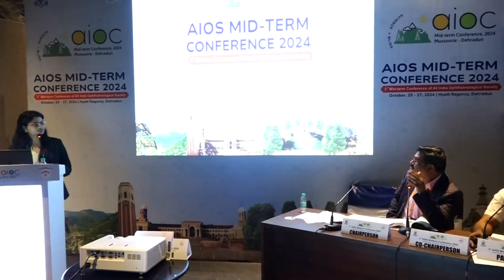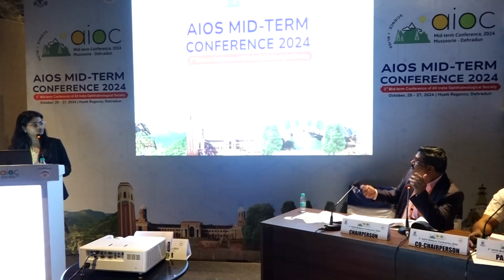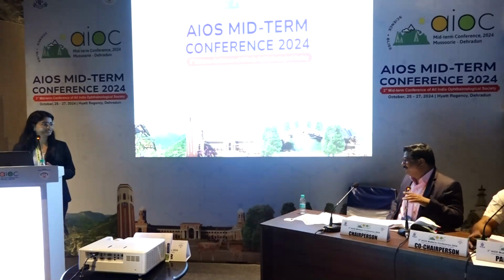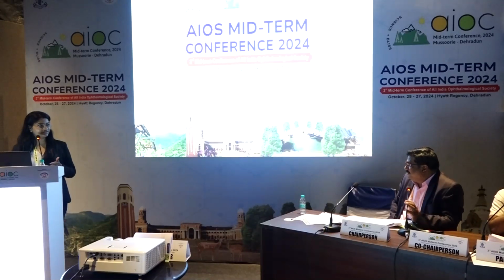So you said that it is basically resource limited. So how does it make the difference? The crescent is around 30 rupees or the keratome is also 30 rupees? But we are doing surgery with only one instrument. Means incision was also taken with the keratome only, and tunnel was made with the keratome, and side port was also done with the keratome.